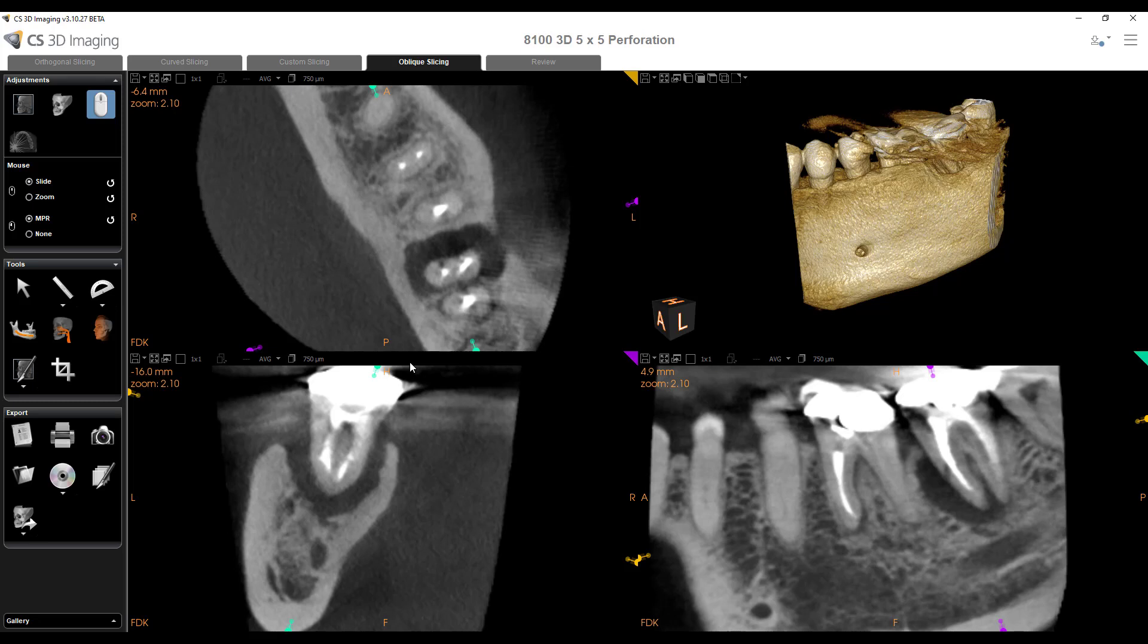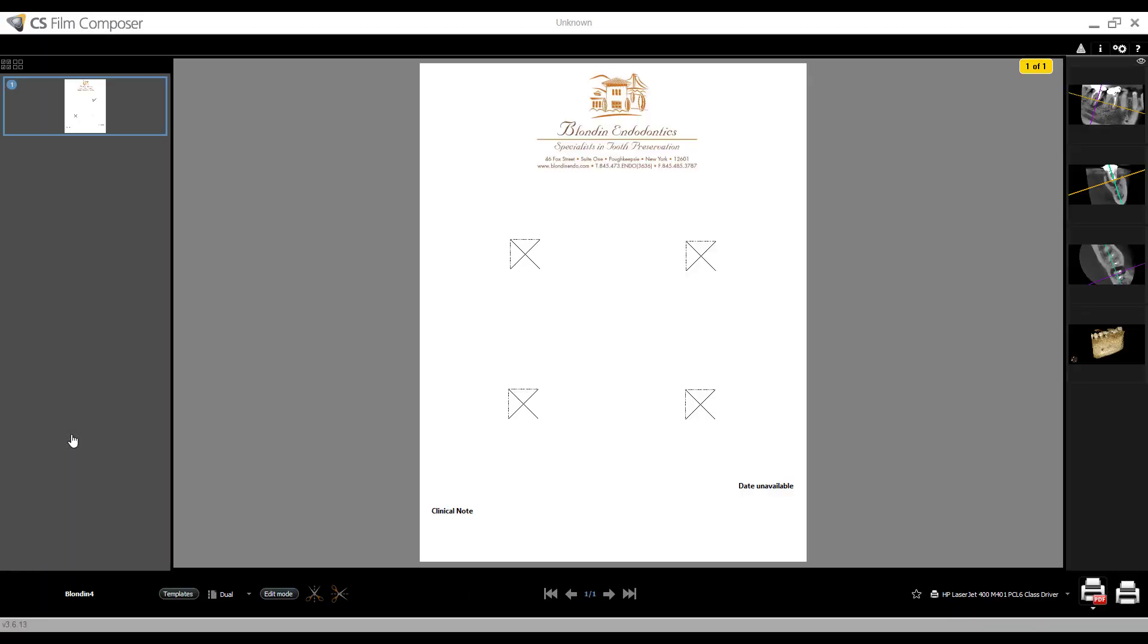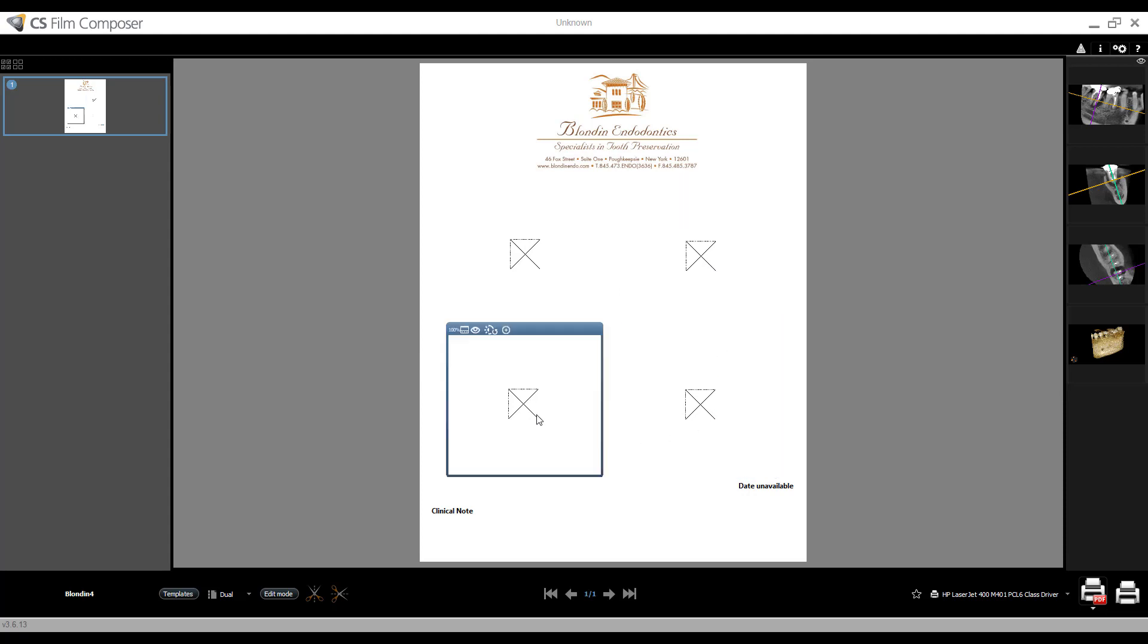Hey, this is Phil Leinberger of CareStream Dental. So you might be aware you can create a custom referring dentist report or patient report right from your CS 3D imaging software by selecting the film composer report and having that custom report automatically launched. And if you know that, well done.